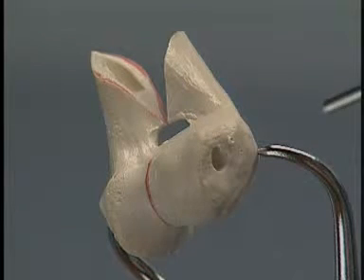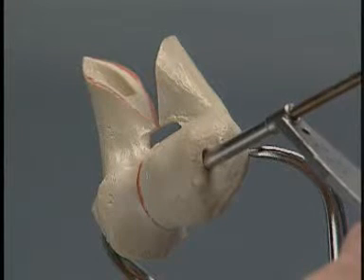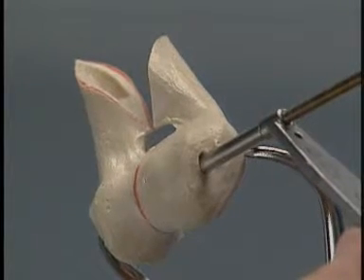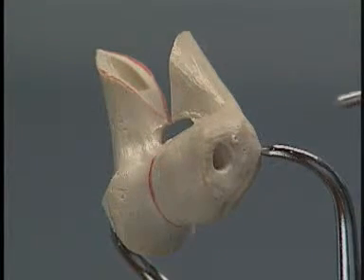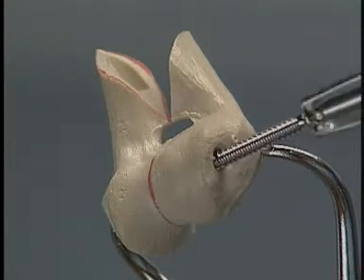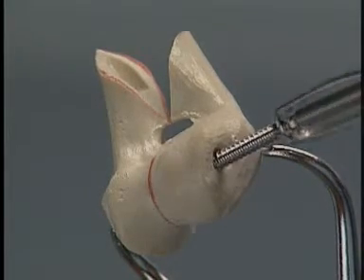After the glide hole has been drilled, the appropriate end of the double drill sleeve is inserted into the glide hole, and the thread hole is drilled. Following countersinking, measuring, and tapping the hole, the cortex screw is inserted, providing lag function.